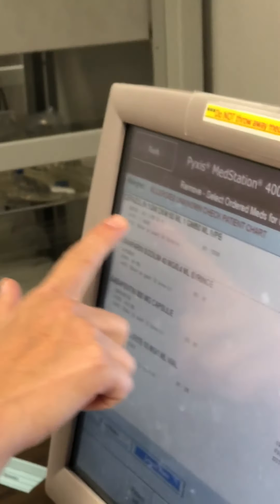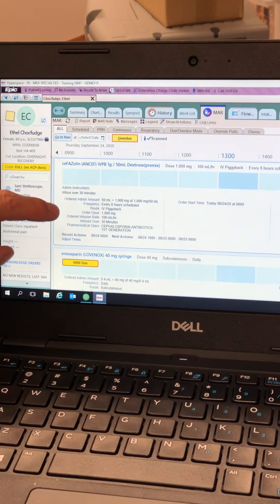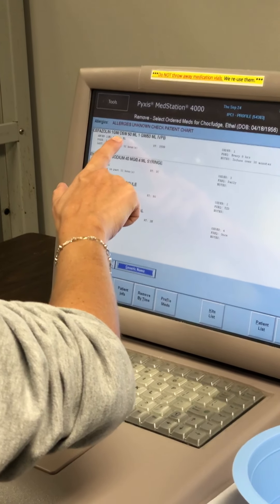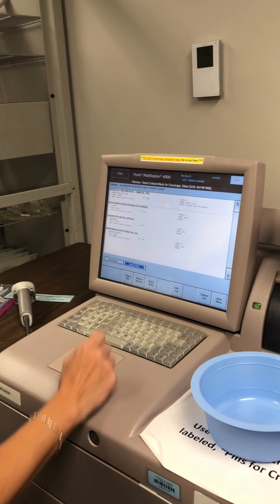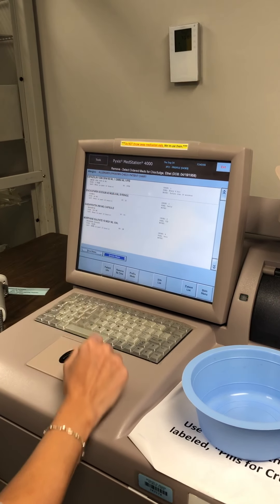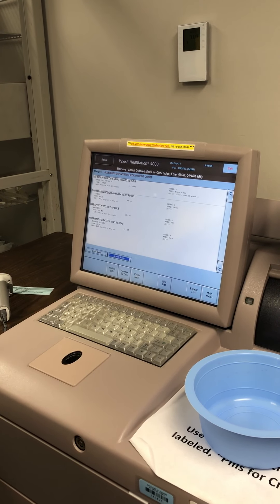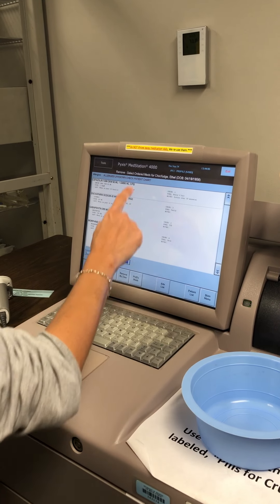I'm giving one gram here, and I'm looking to find my dose — I am going to give one gram. I'm going to make sure this is in 50 mils of fluid, and here it's also in 50 mils of fluid. So everything looks good. IV piggyback is my route, IV piggyback is my route. It's the right patient, it's the right dose, it's the right med, it's the right concentration. Everything looks good.